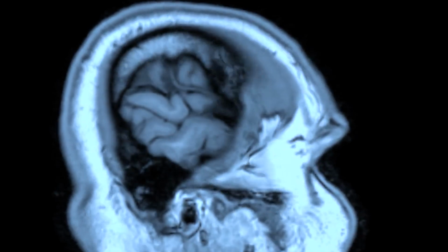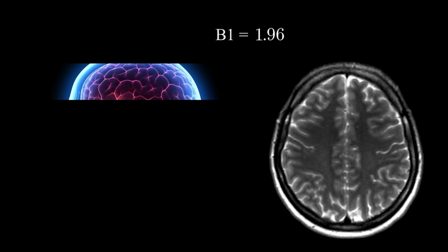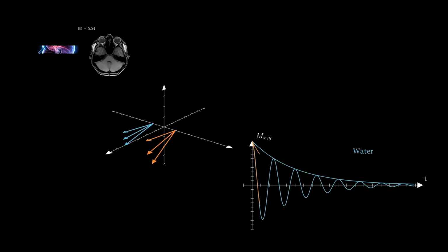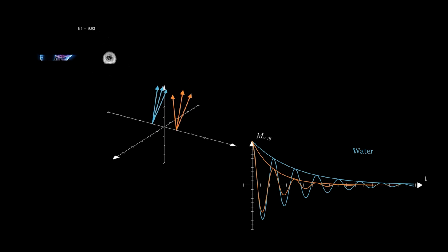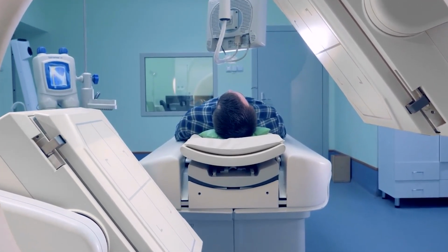All right, we've managed to grasp a good portion of how magnetic resonance imaging functions. We've seen how to choose the image slice from head to toe by selecting the resonance frequency. We've also understood that it's through the difference in T1 and T2 decays that we can distinguish between tissues. In the upcoming videos, we'll delve into how this measurement is carried out and how we transform these measurements into an image.